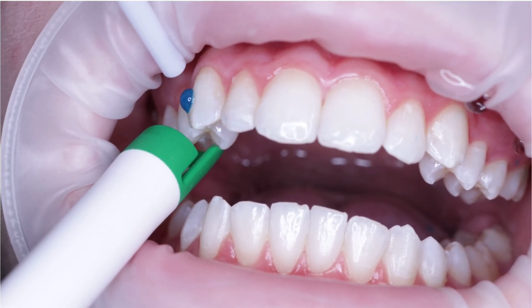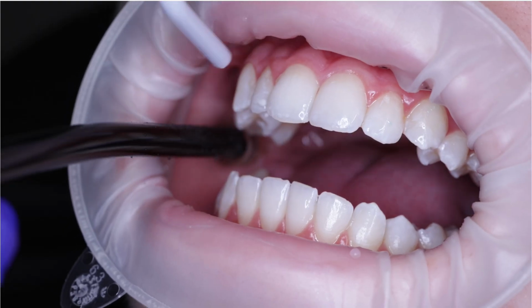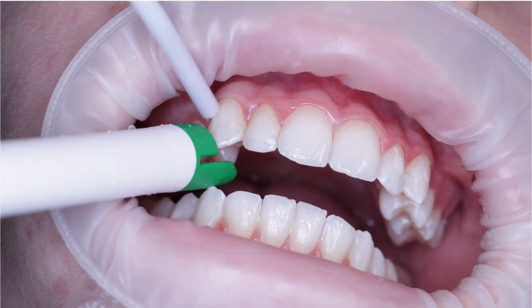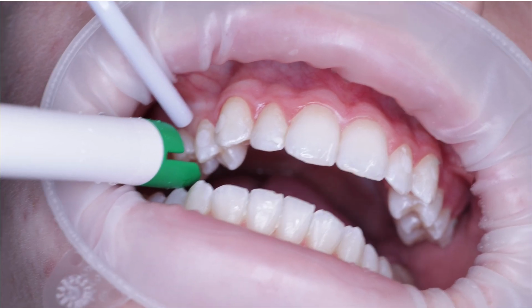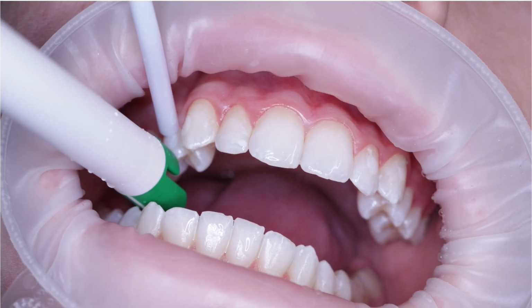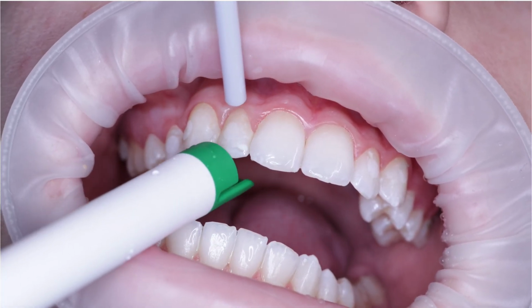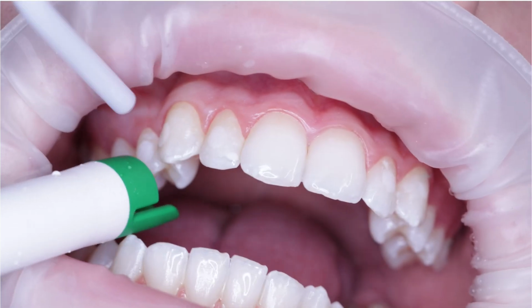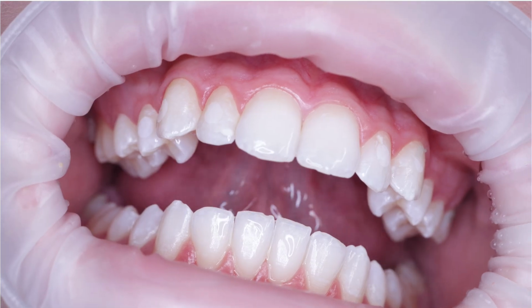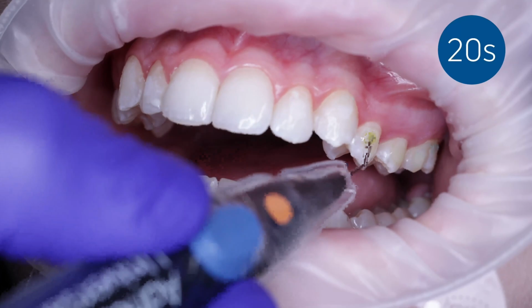Here I'm utilizing the Optragate 2, which is from Ivoclar. I cannot work without this product. And this is why. You see, as I'm trying to dry everything off, if I try to use cotton rolls, oh my gosh, I've been there, done that. I'm too old for that. I'm not going to sit and wrestle with a patient and wrestle with that tongue. I want to make sure things are nice and dry, and this really and truly is the reason why we just don't have attachments coming off. But you'll notice everything is nice and frosty, right? Nice and frosty. If it is not, we have to re-etch, okay? So we would go back and we would re-etch.